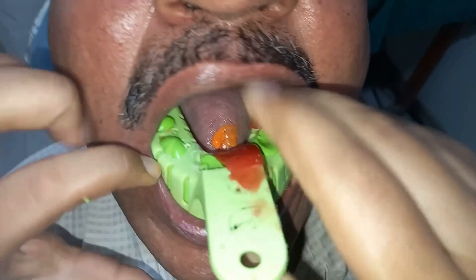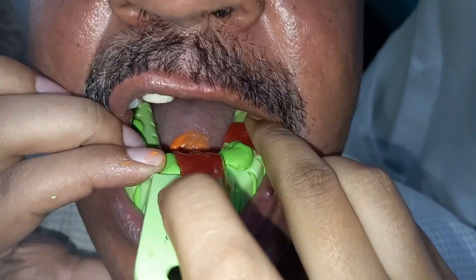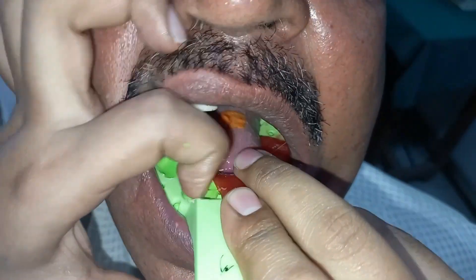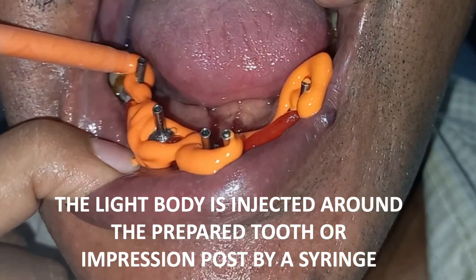A part of the light body is injected around the prepared tooth or the impression post using the mixing tip. Then we insert the tray in the mouth and wait until it is set. As you can see in the figure, we have putty in green and light body applied directly onto the tray. The light body is automatically dispensed and mixed from the mixing tip, and part of it is injected around the tooth.